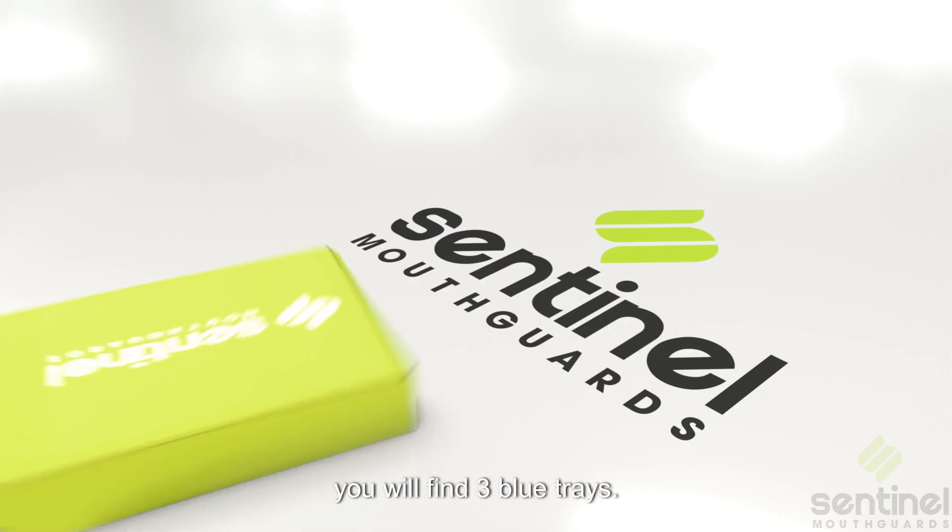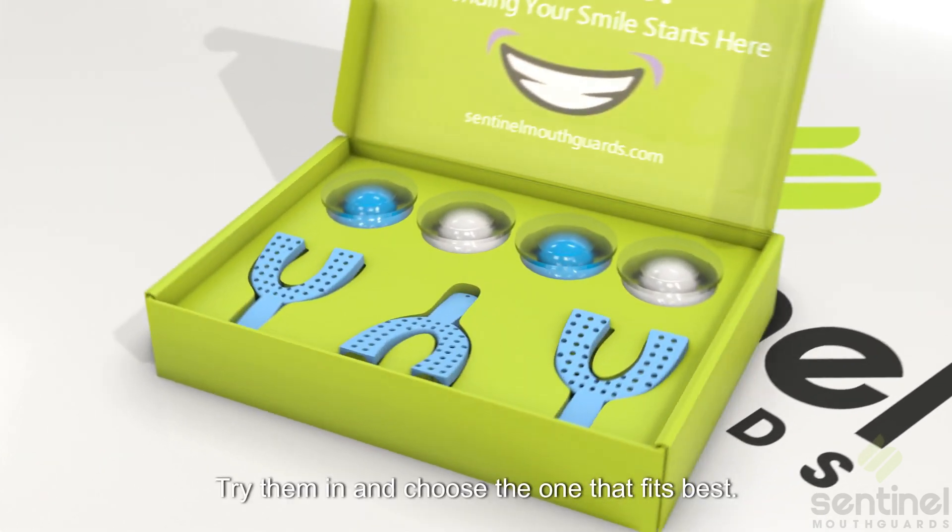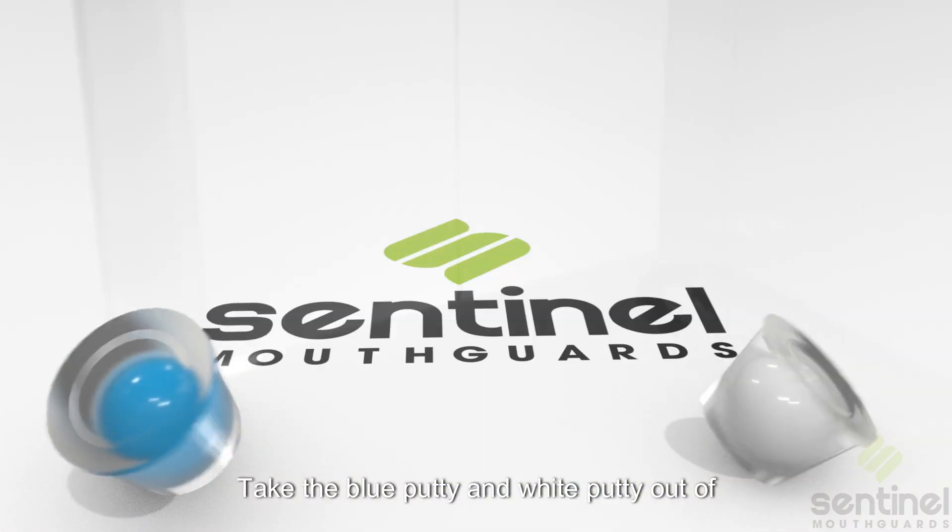Enclosed, you will find three blue trays. Try them in and choose the one that fits best. Take the blue putty and white putty out of the packs.